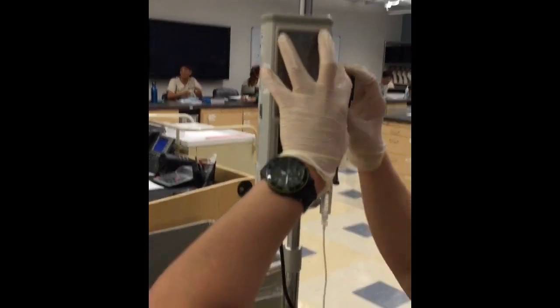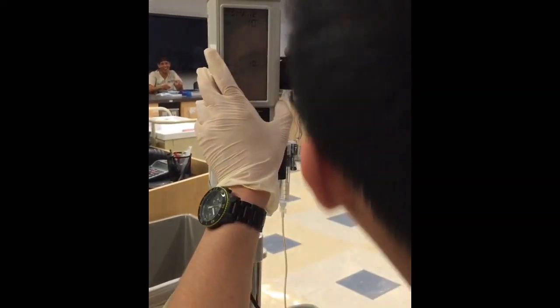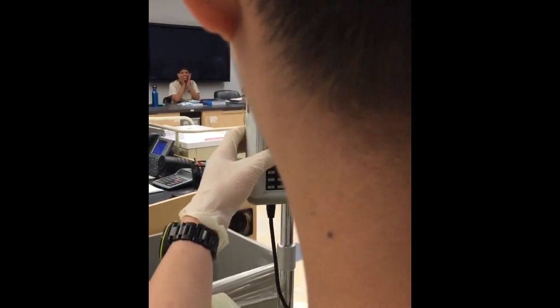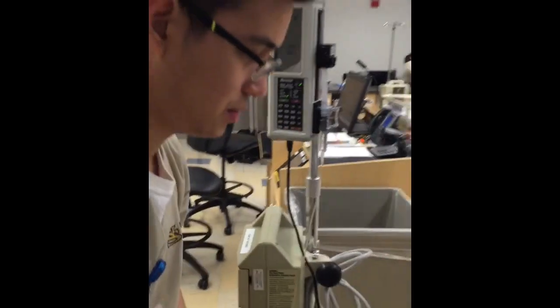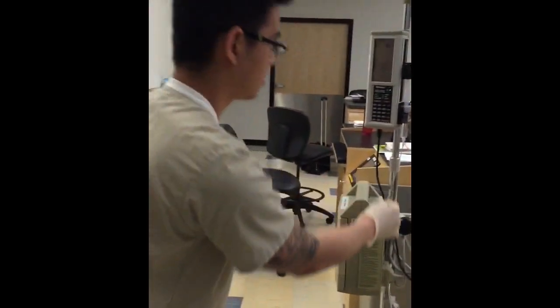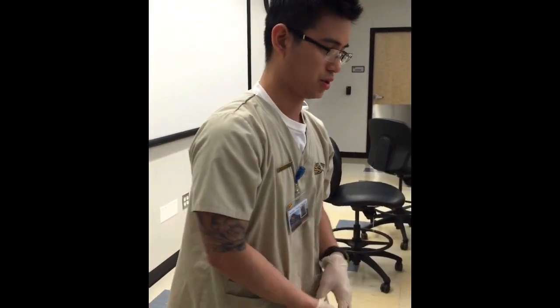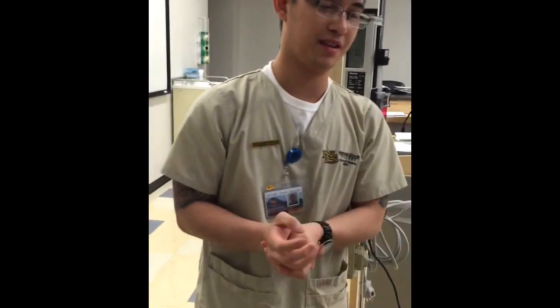Just be very careful so you won't spill any medication. It's running — everything is good. Make sure that you check for any bubbles and make sure you unplug this. Now it's good. You can see the medication going — come back in 10 to 15 minutes to check your patient. I'll be right back to check on your baby. Make sure to call and let me know if you need help.